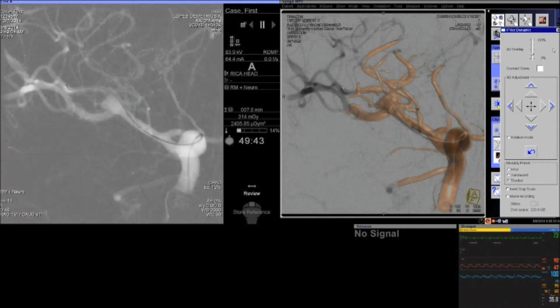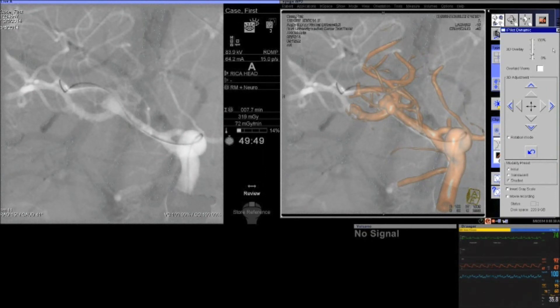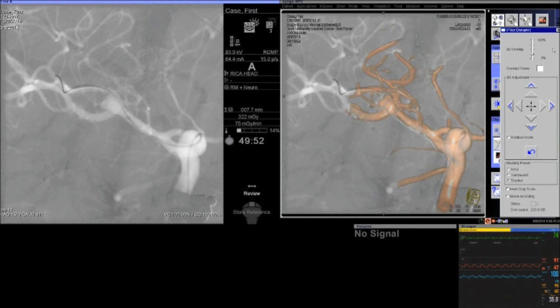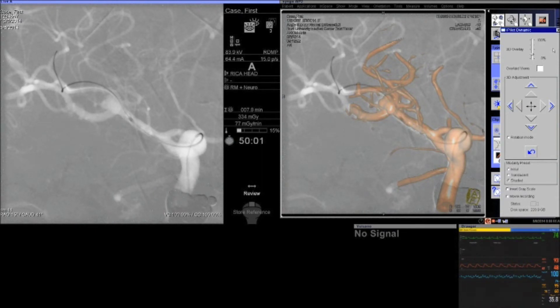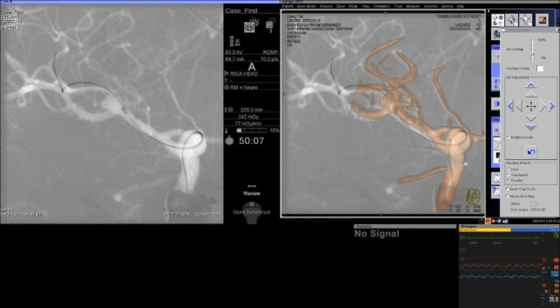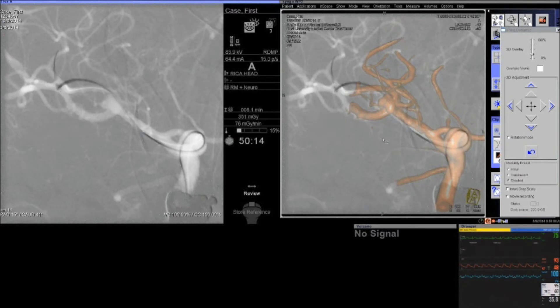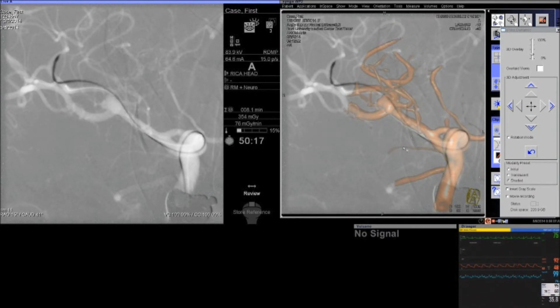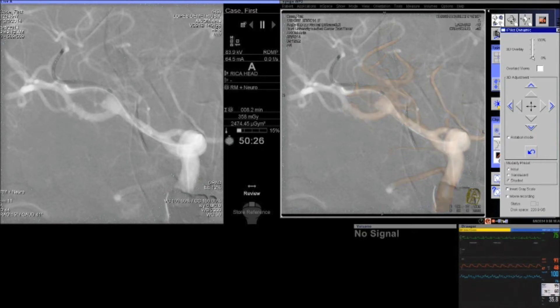We need to do a roadmap to look at the distal anatomy. As we position the 14 wire, we want to get significant purchase into the distal vessel, but be very careful about not perforating the small vessels as the anatomy gets more distal. You want to position the wire — the transition portion between the soft and more sturdy segment — right at the bifurcation, so the microcatheter goes through the aneurysm area without buckling into the aneurysm. This distal placement of the microcatheter is crucial so that when you navigate your stent into this location, you will not lose your catheter position.